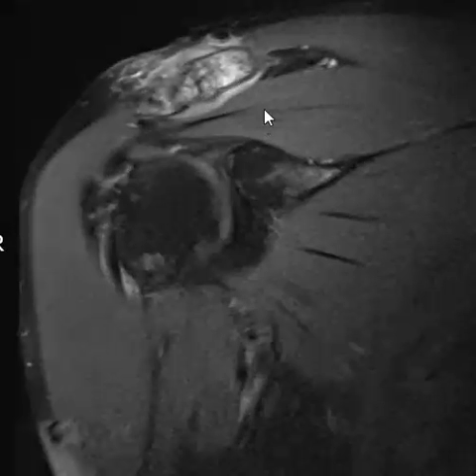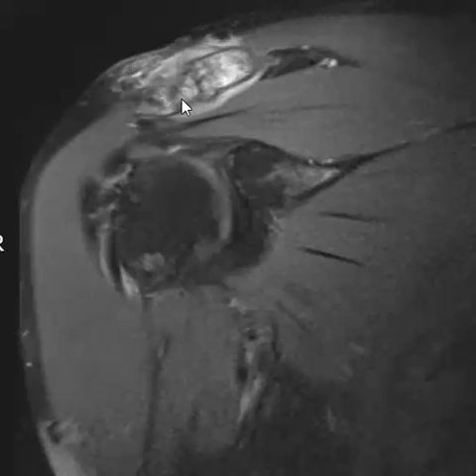On plain films this will look lucent, and that's why they call it osteolysis. In the olden days they would see lucency of the distal clavicle, but now with MRI you can see this intense marrow edema — the bone is getting resorbed and eroded. And that's it: a case of really prominent marrow edema compatible with AC osteolysis.